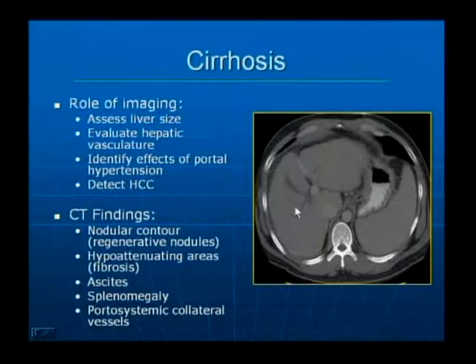If the patient has an elevated alpha-fetoprotein or has any signs to suggest malignancy, very often these patients will be followed both with checking alpha-fetoprotein and checking with triple phase studies. That could be either a CT or an MR. Very important to do that in 3 phases: pre-infused, arterial, and redistribution phase to look for the lesions.